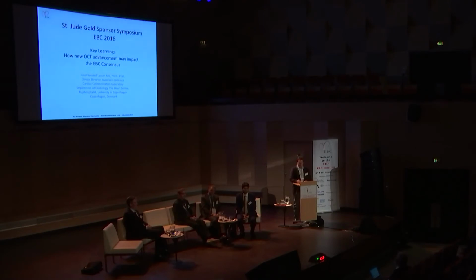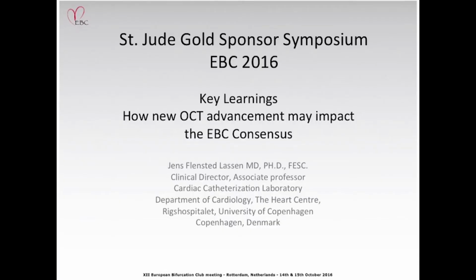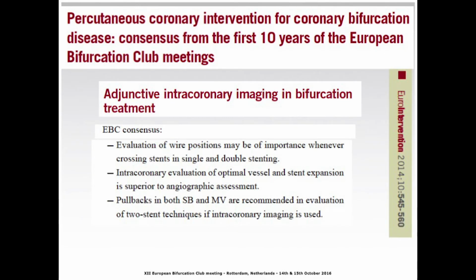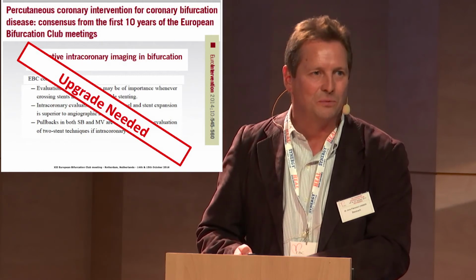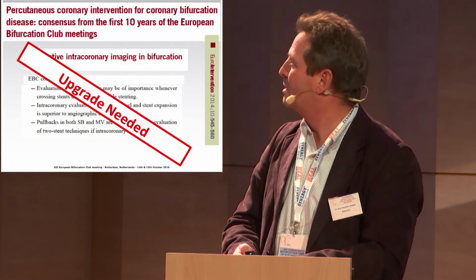The key learning from the session is actually that we need to upgrade our consensus. This is the 10 years consensus, it's 2 years back, and I basically just think that we stated that it is nice to use some intravascular imaging when you're doing bifurcations.